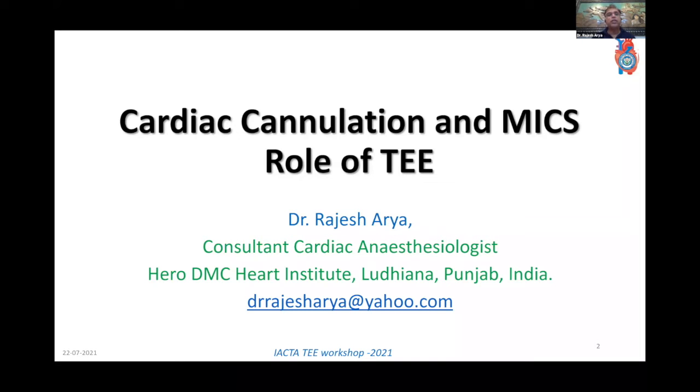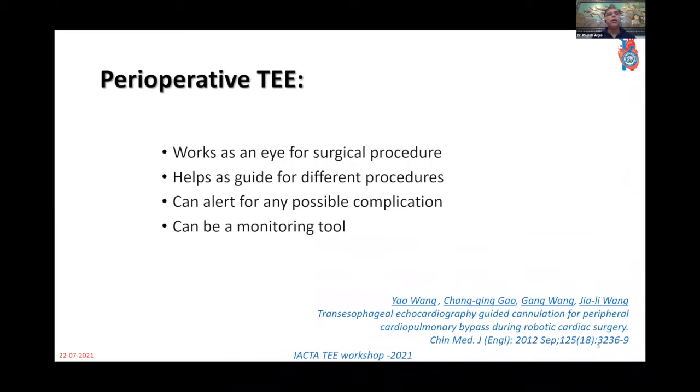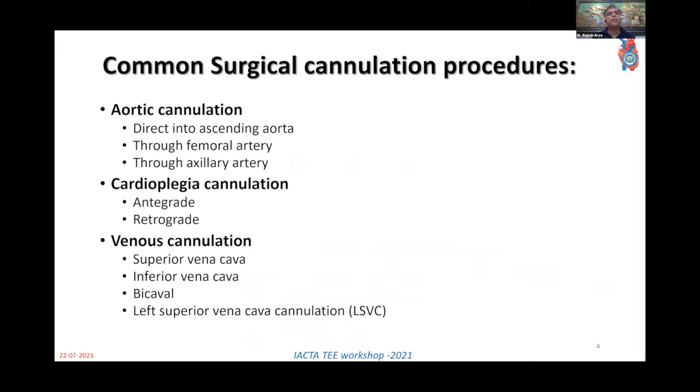So this year, the topic given to me is the cardiac cannulation and minimal invasive cardiac surgery and how the TE can be helpful to that. Perioperative TE has been proven by many papers, and this is one of the good papers published in 2012, which says that the TE works as eye to the surgical procedure. It helps us guide for different procedures. It can alert us for any possible complications, and it gives a monitoring tool also that what is happening inside.